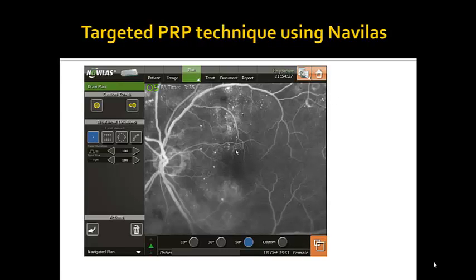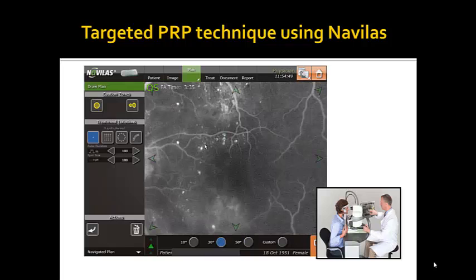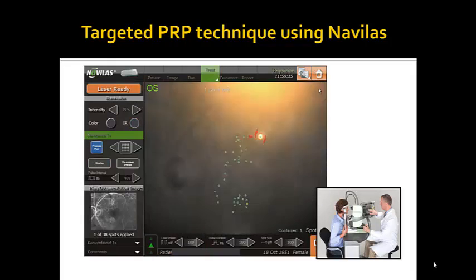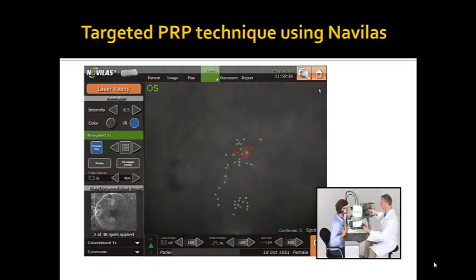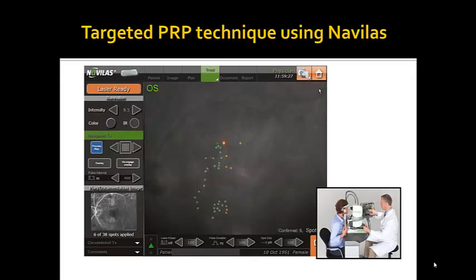Furthermore, as with focal treatments, the treatment aiming beam is positioned onto the planned locations. The surgeon needs to confirm correct positioning for treatment prior to the application of laser.